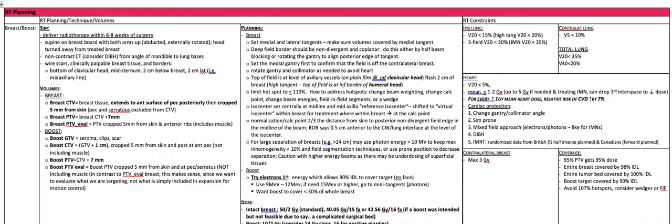A high tangent is such that the top of the field is at the inferior border of the humeral head. You want to limit hot spots to less than 110 percent. There are ways to address hot spots including changing the beam weighting, changing the calculation point, changing the beam energies, doing field-in-field segments, or adding a wedge.